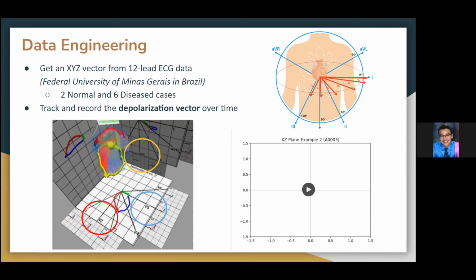Well, in a general sense, the EKGs for normal people will have the same shape and structure. As Austin explained earlier, if you have a lot of EKG data and feed it to some kind of machine learning algorithm, it can differentiate normal versus disease and different diseases pretty easily. So from case to case, they're relatively similar, but there can be discrepancies within a disease itself or in the normal population. So in general, right now, yes, the approach of taking a 12 lead ECG data for a person and then putting it into this program is effectively simulating that person's case.